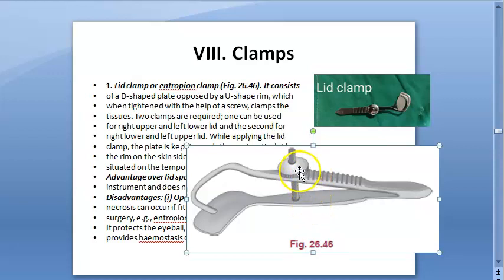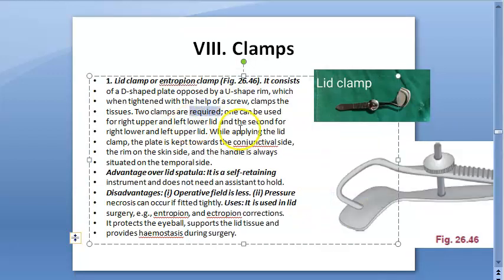You can tighten it with a screw. There are two types of clamps here. One can be used for the right upper or the left lower lid, and the other for the right lower or the left upper lid.